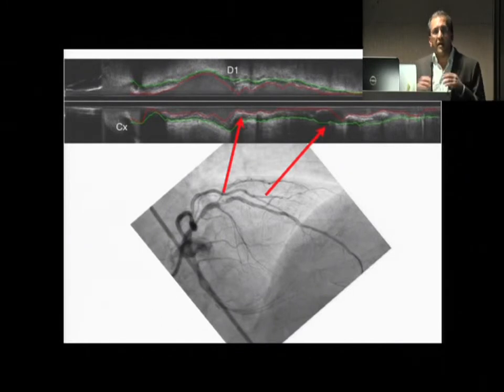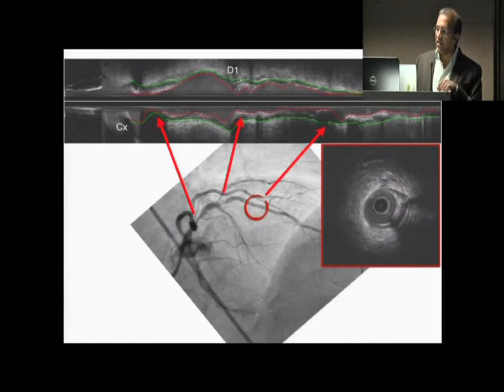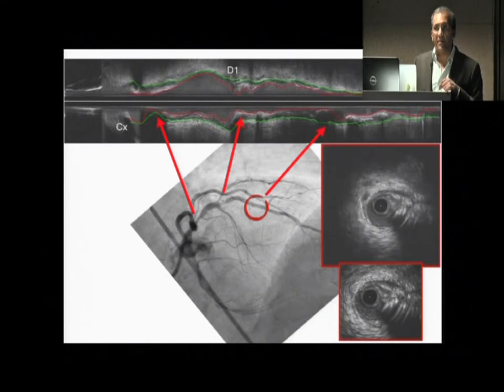And when you look at this, as against what we did today, if you were to put a discrete stent in the proximal LAD here, in the mid-LAD, your edge of the stent would be at a dissection flap, which you would have missed angiographically. And the proximal part is here. So here is the edge. Can you see a flap coming in right over there? Can you see that flap? And here is a frozen picture of that flap. You couldn't miss it. You have to cover this with an angioplasty when you're doing a PAMI.